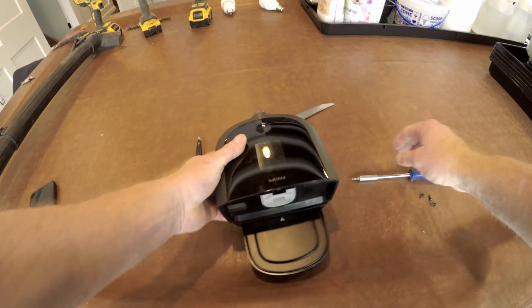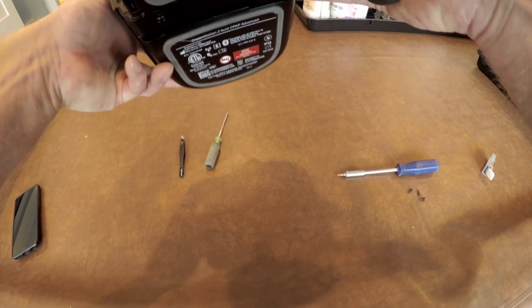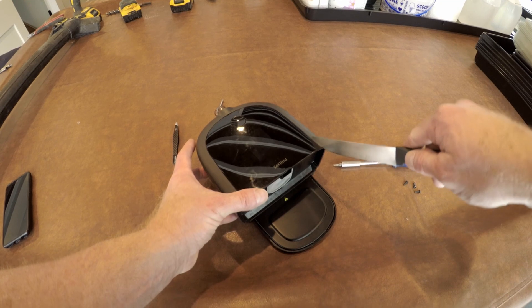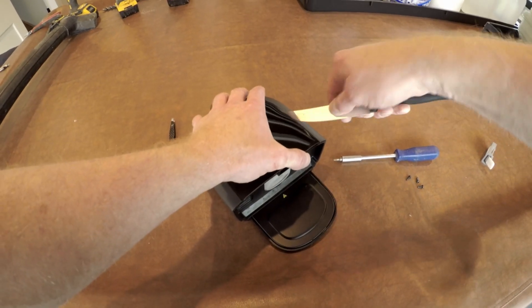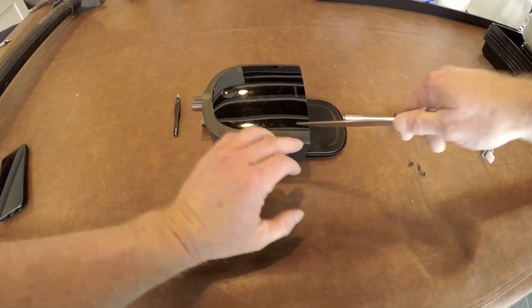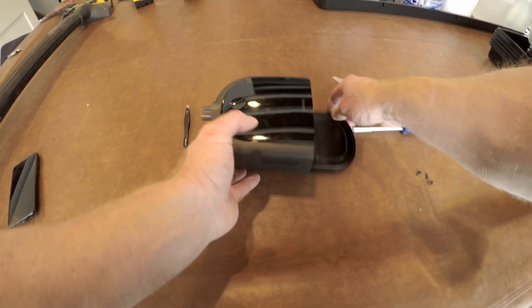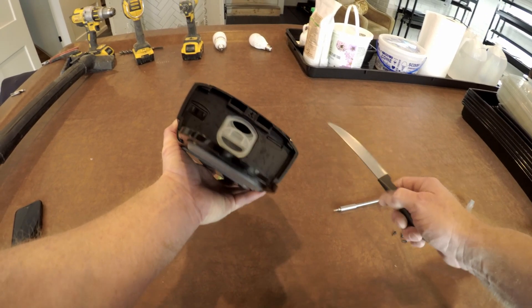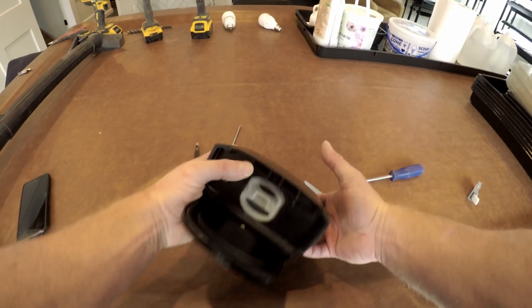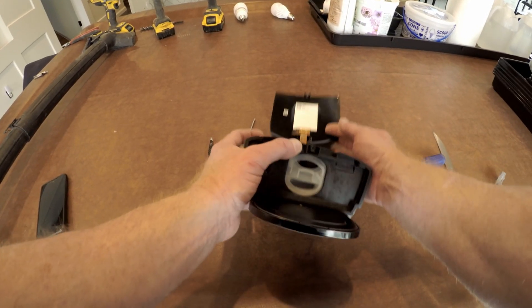The top panel is held on with about five little tangs. You take your knife blade and kind of slip it in between the two pieces of plastic and do a little bit of prying, and the top panel will flex enough for the little tangs to pop out of their sockets. There's a hasp-type deal on the back that you just have to pry loose — a small screwdriver would work better than a knife blade to pop it loose. Then the top panel just pops off.